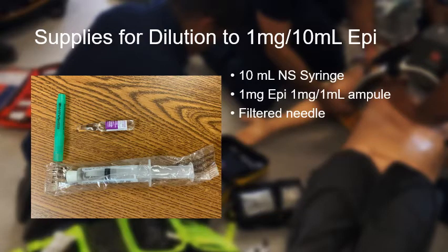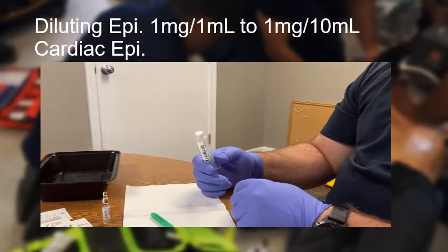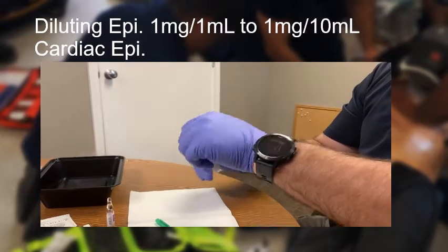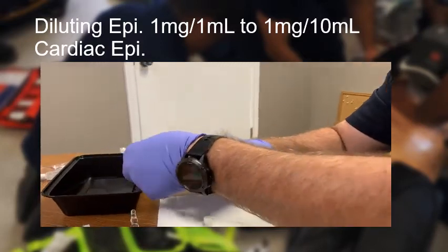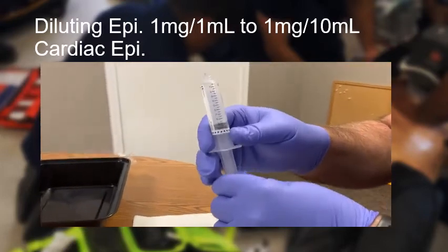The supplies needed to dilute 1 milligram per 1 ml of epinephrine to 1 milligram in 10 mLs of epinephrine are as follows. You will need a 10 ml normal saline prefilled syringe, 1 milligram of epinephrine 1 milligram per 1 ml ampule, and a filtered needle. Using a 10 ml prefilled normal saline syringe, expel 1 ml of fluid. This will leave you with 9 mLs of normal saline.